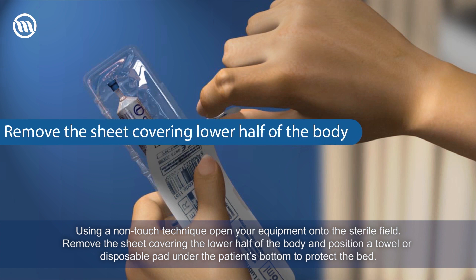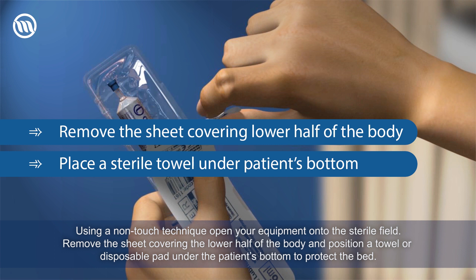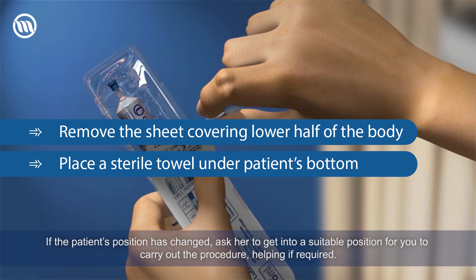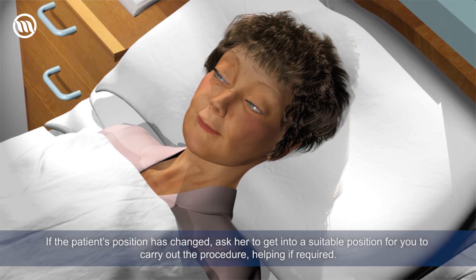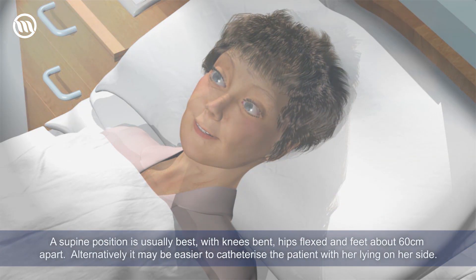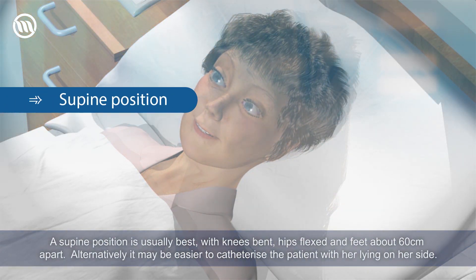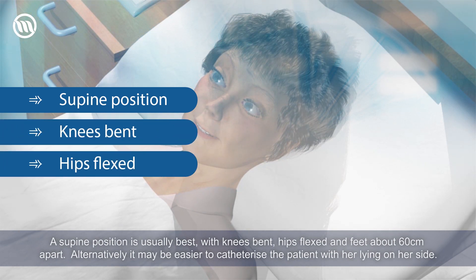Remove the sheet covering the lower half of the body and position a towel or disposable pad under the patient's bottom to protect the bed. If the patient's position has changed, ask her to get into a suitable position. A supine position is usually best, with knees bent, hips flexed, and feet about 60 centimetres apart.